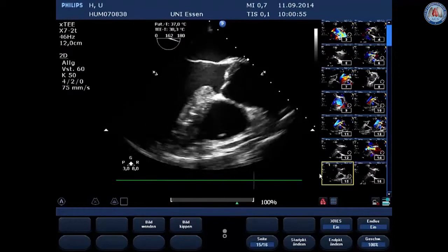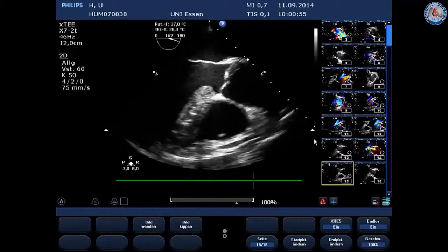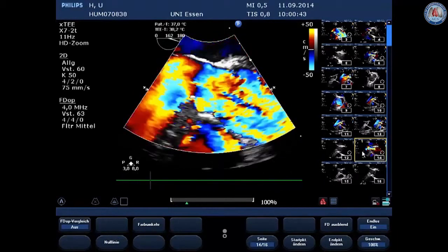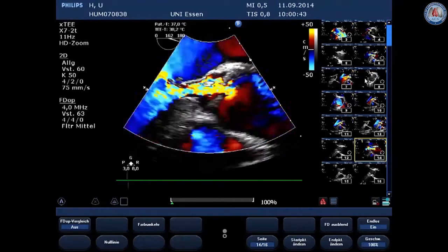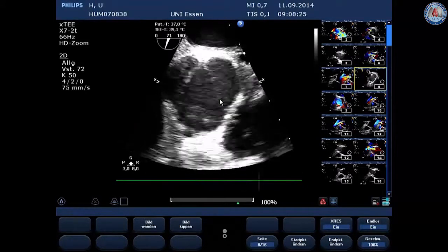As we can see here, there is a slight difference to the case in OR1. We do see the aortic root, but we do see this is not dilated this time. But we see here also already in the native view that there's a coaptation gap, and adding color to it, we see that there's a severe aortic regurgitation. Vena contracta here was measured 0.6 centimeters, so this is a classification of a severe aortic regurgitation. And we see that the problem is that the leaflets are thickened, but also that there is a slight prolapse of the leaflets.